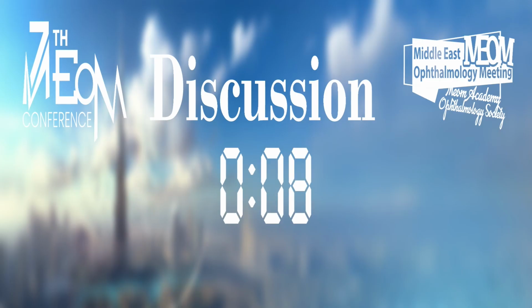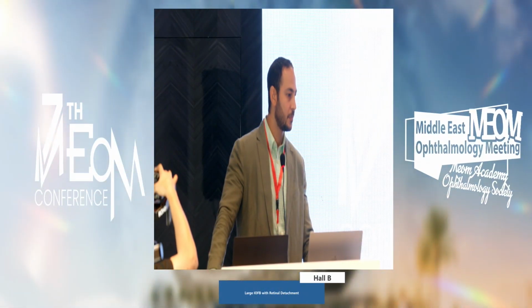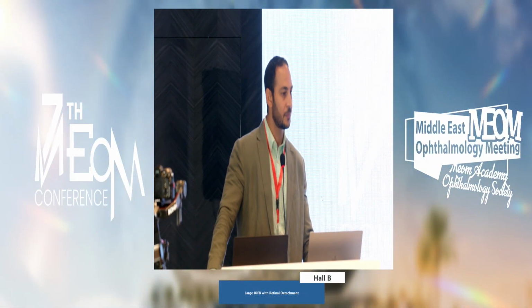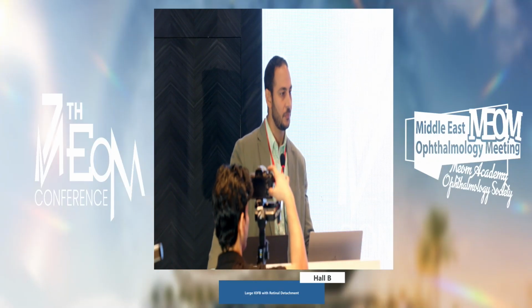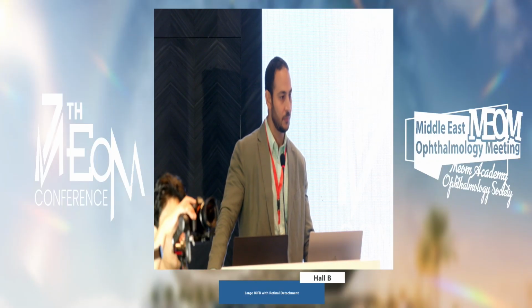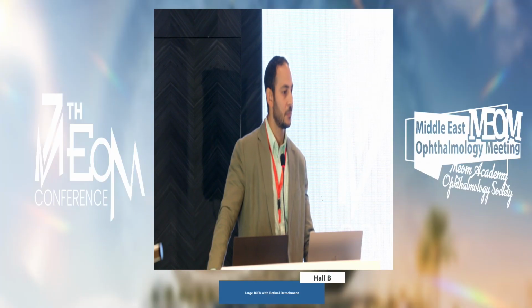I thought there was a tiny PFCL bubble temporal to the macula, but that bubble which was in the AC was seen at the end of the video. Yes. So we should have tried to push it back with viscoelastic. And definitely when we are removing the foreign body and taking it out of the AC, we must put viscoelastic on the endothelium. Otherwise, the cornea will decompensate. Yeah, sure.